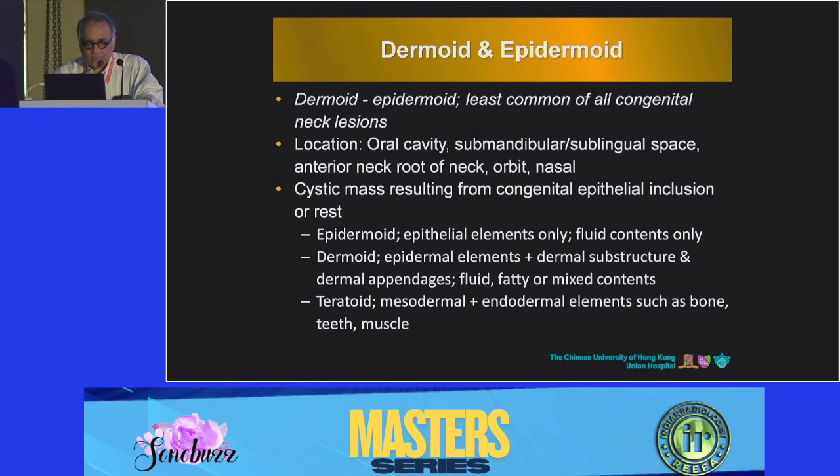So let's look at some dermoids, epidermoids. Remember, epidermoids have more fluid. Dermoids usually don't have that much fluid. So to distinguish an epidermoid from a dermoid is usually the amount of fluid within that lump. Sometimes in an epidermoid you will see squamous pearls inside. Those are squamous cell nests that have coalesced together. So if you see squamous pearls, this is more likely going to be an epidermoid, or rather not a dermoid. So these are a few clues that will separate an epidermoid from a dermoid, but its location is the same, midline. So let's have a look.